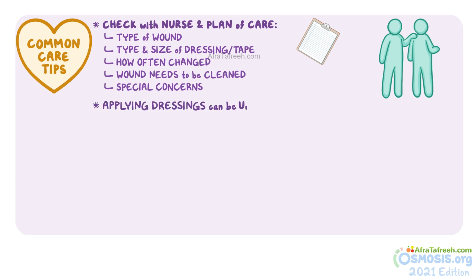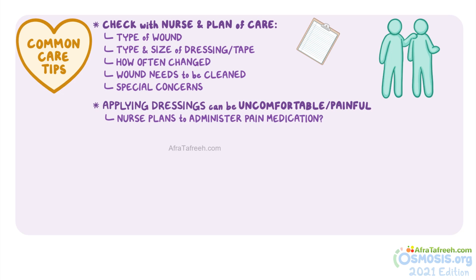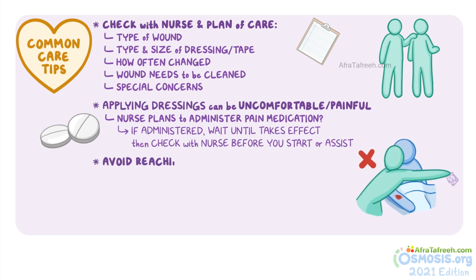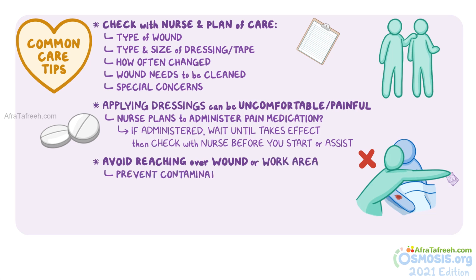Applying dressings can be uncomfortable and even painful, so find out if the nurse plans to administer pain medication beforehand. If pain medication is administered, wait until the medication takes effect, then check with the nurse before you start or assist with the procedure. As you apply the dressing, avoid reaching over the wound or your work area. This will help prevent contamination.